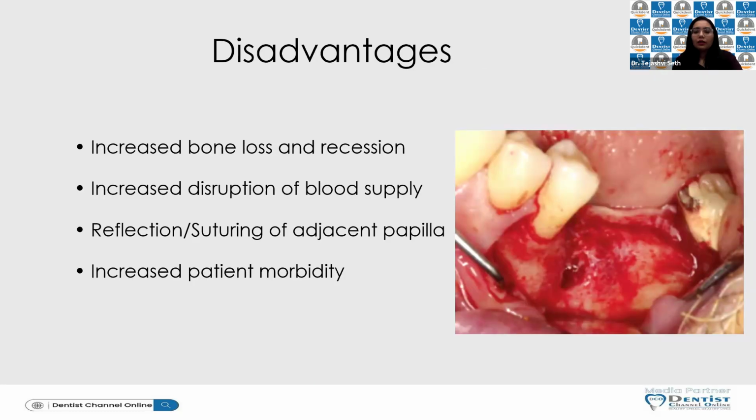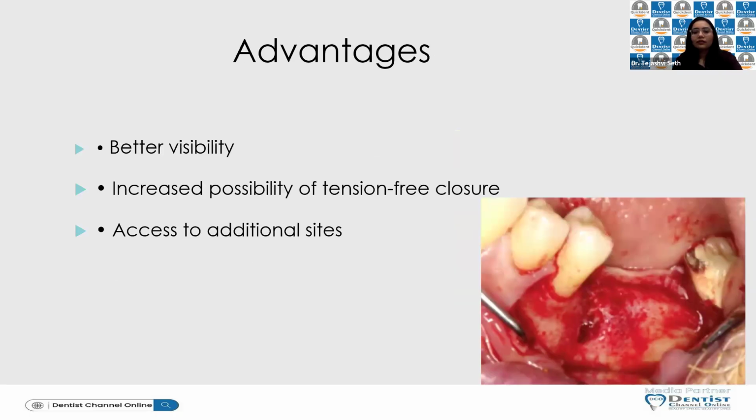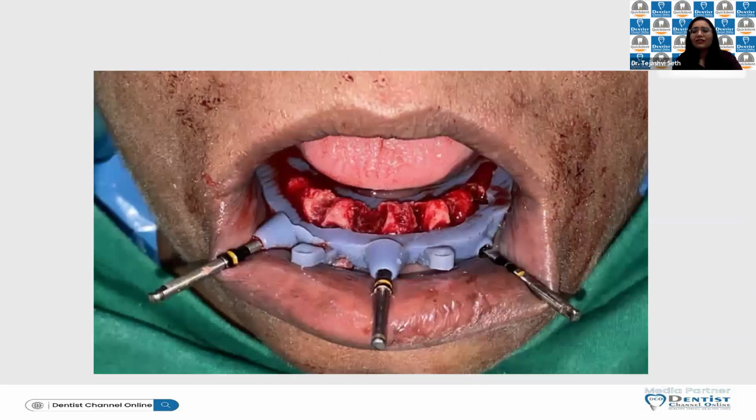Now we have talked about augmentative procedures. Now, what if we require reductive procedures? See, in case of full mouth implants, you can go flapless. You have your dentures, you can go flapless. You have your stent again. But sometimes you do require bony reduction.